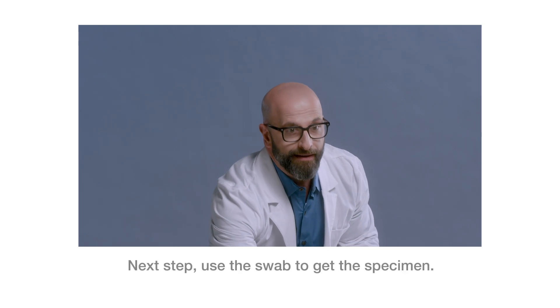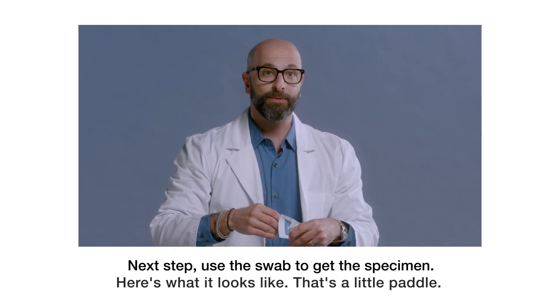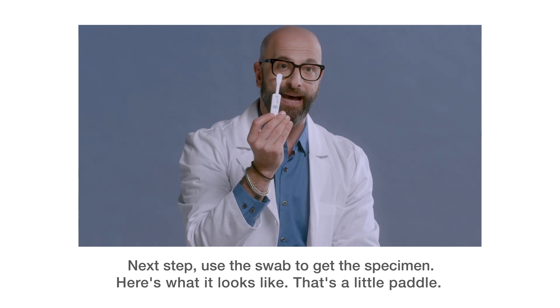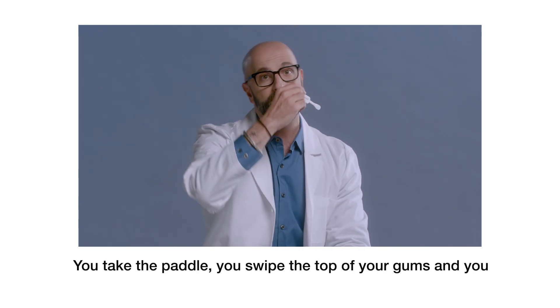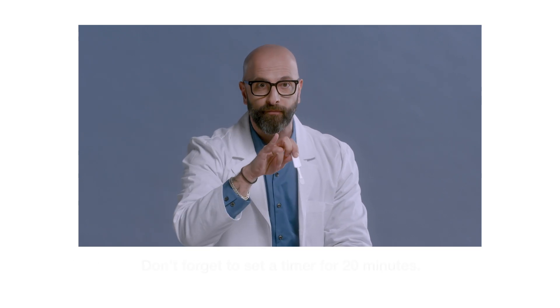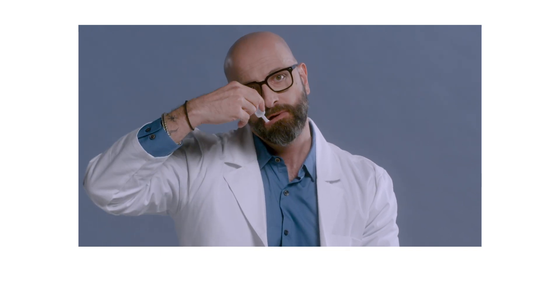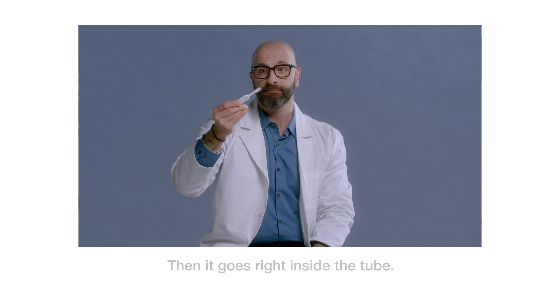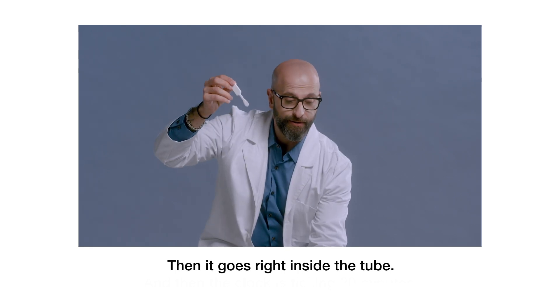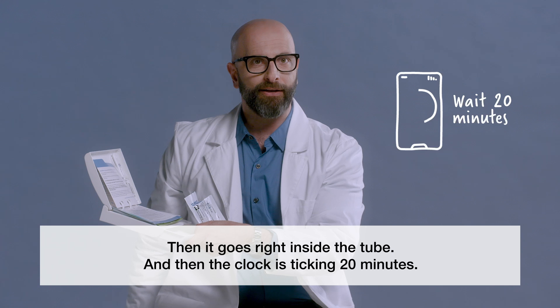Next step, use the swab to get the specimen. Here's what it looks like — that's a little paddle. You take the paddle, you swipe the top of your gums and you swipe the bottom of your gums, and you put that into the tube. Don't forget to set a timer for 20 minutes. Then it goes right inside the tube, and then the clock is ticking.